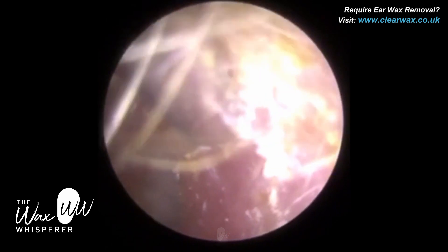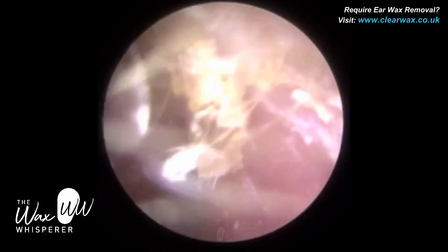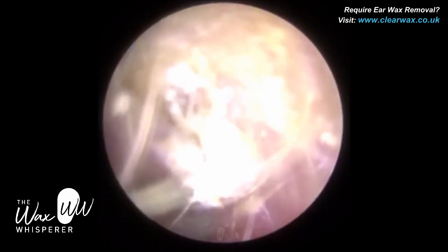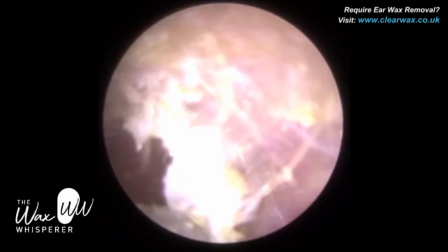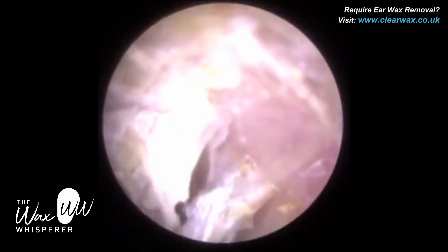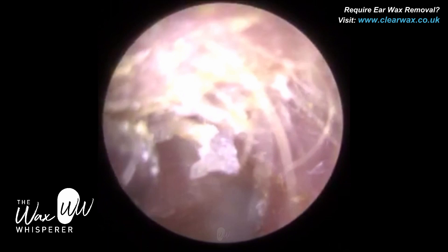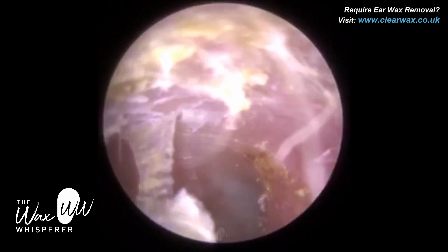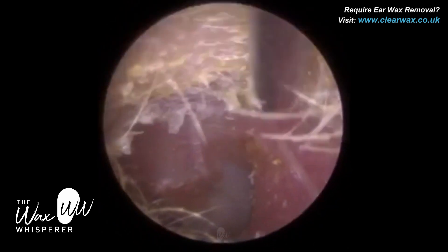The skin that lines the inner two thirds of the ear canal — the bony part — is less than 0.1 millimetres in thickness, whereas the skin that lines the outer third of the ear canal, the cartilaginous portion, is about one millimetre in thickness. And if you cut into this skin and abrade the bone, it's going to be very uncomfortable for the patient and it can lead to further infection. So there's some very dry skin at the roof of the ear canal — just using the fine end, trying to remove as much as I can.